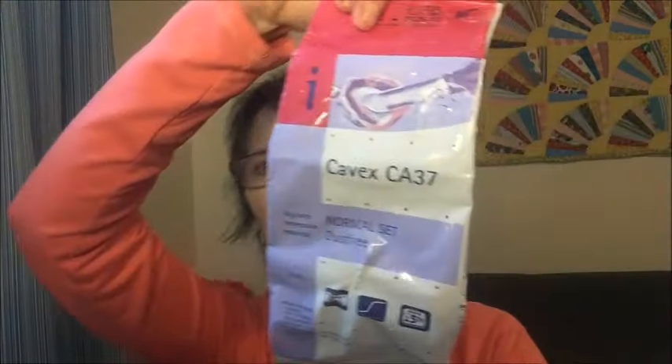You need alginate powder to take your impressions. A lot of the stuff I got from different places — some from Amazon, some from eBay, some from Gary, the guy who sells the instructional DVD. He does have some items available. This is the alginate to make impressions — I put it in a different container.